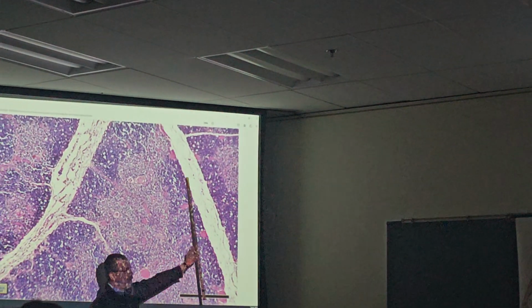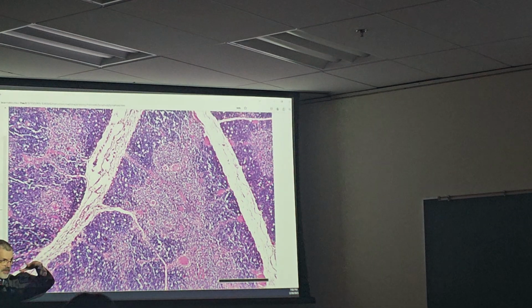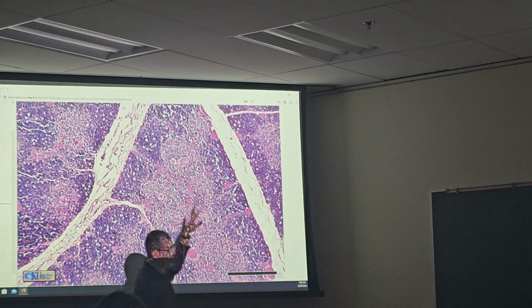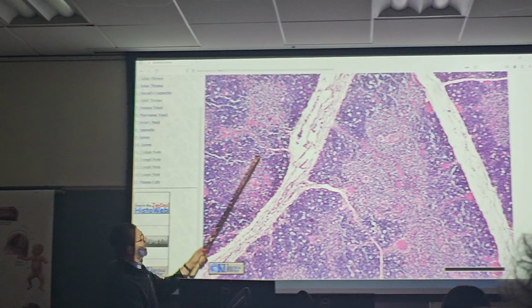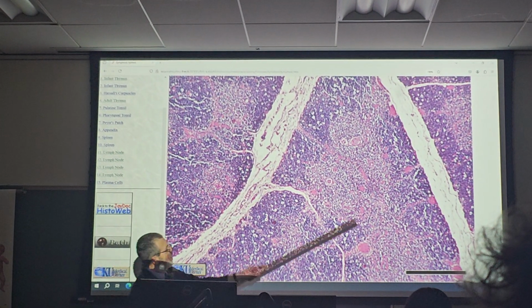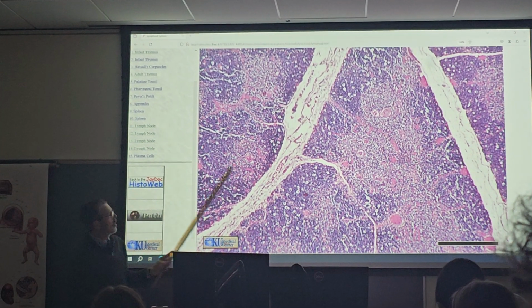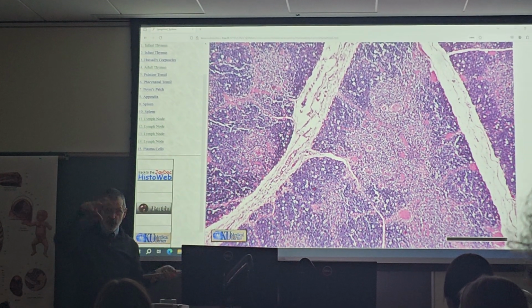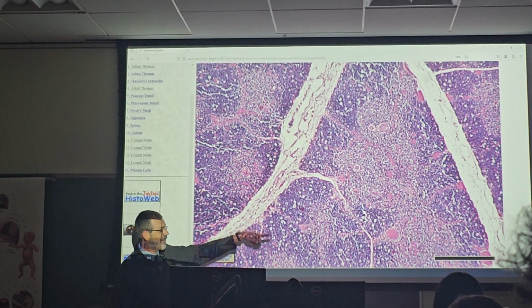Here's a septum, a wall. There's actually a wall right here too. The white big rooms are made out of septa. So this has about 2 or 3 septa on it. The room is called a lobule, because it's like a lobe, like your lung. One lobule, one lobule, one lobule. Those are individual compartments. Each lobule has an outside edge and a middle.